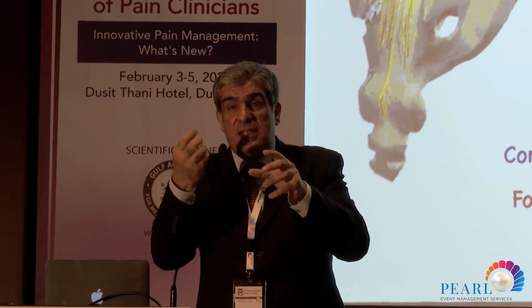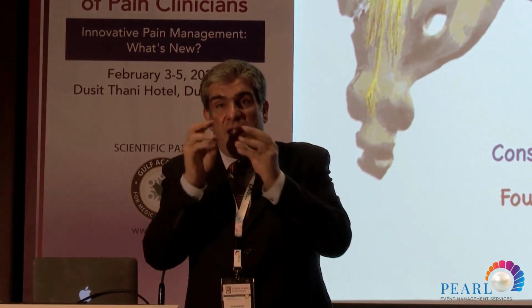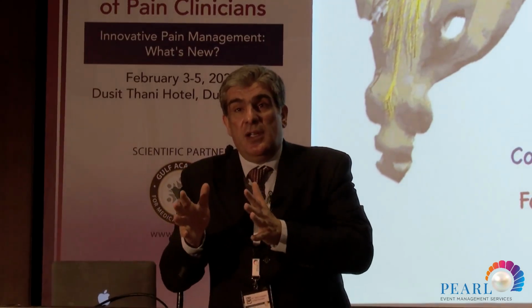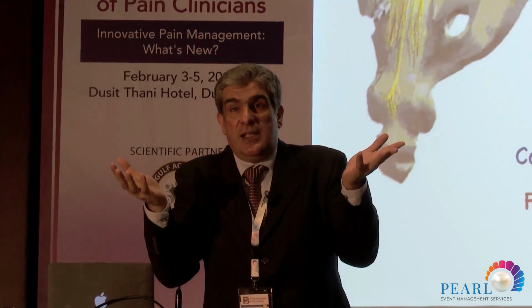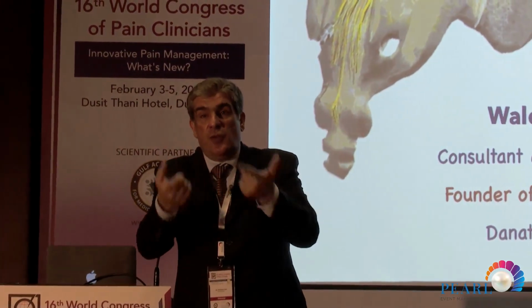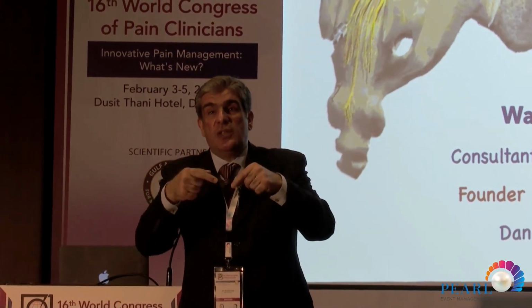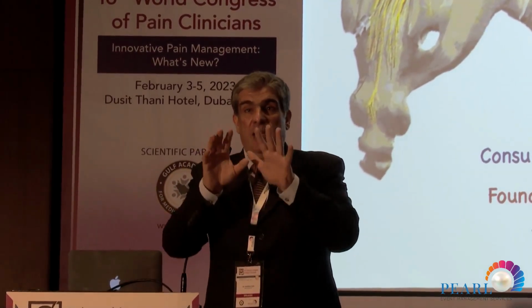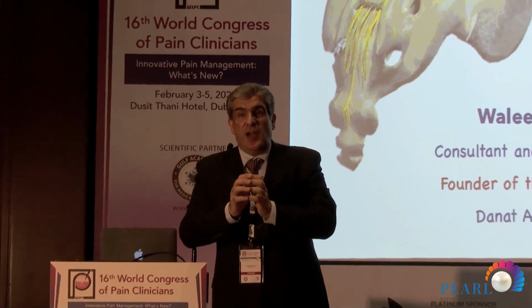Sometimes the nerve is squeezed, and any volume you put there is going to compress the nerve more. So you're not safe nerve-wise. With this, you can visualize the opening, visualize the stenosis, and be sure that what you're injecting is not going to compromise the safety of the nerve. So I don't have yet any published safety for this device. Hopefully soon we'll have a lot of publications and things like that.